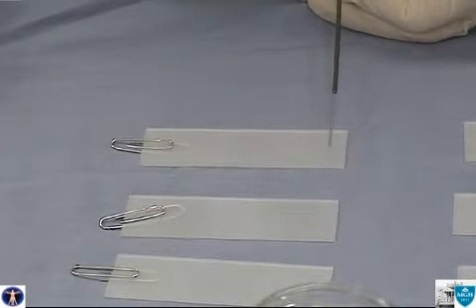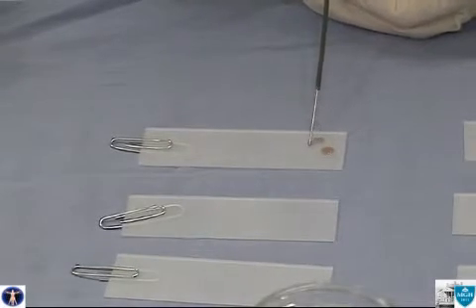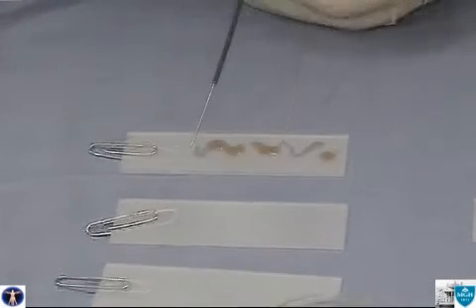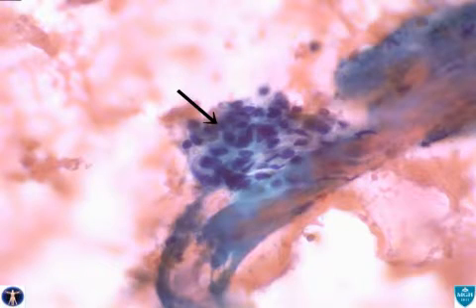The stylet is placed down through the needle and used to extrude the cytologic material from the needle onto glass slides. The cytologic material is placed diffusely across the glass slide, and then a second glass slide is used to smear the cytologic material into a fine, thin film. Staining of the material reveals multiple small cuboidal benign cells without evidence of mucin.